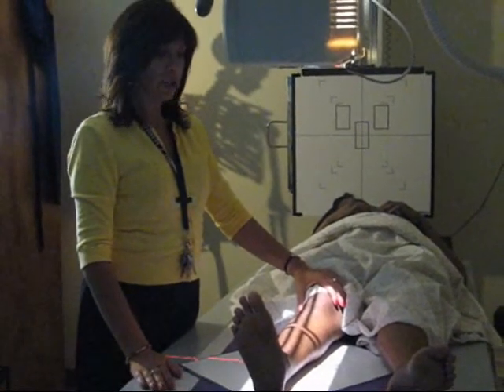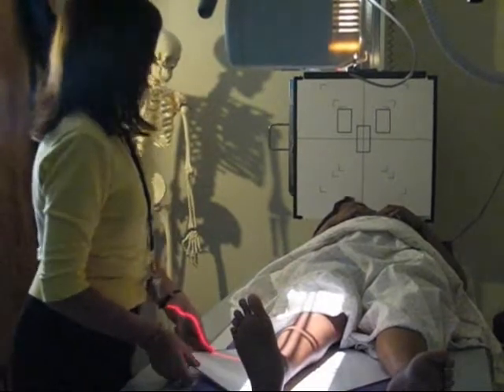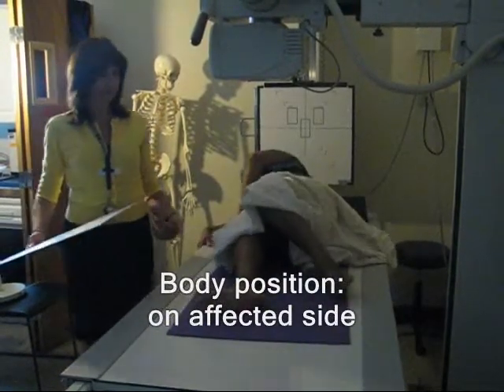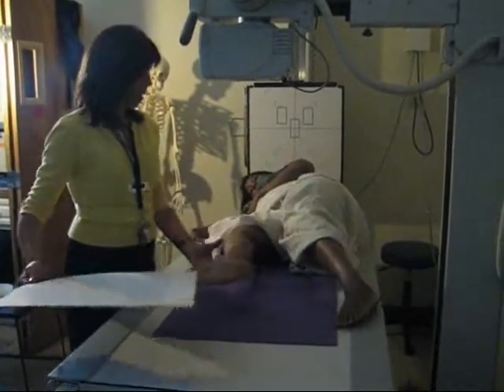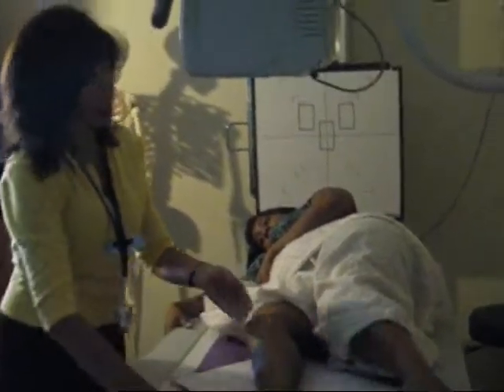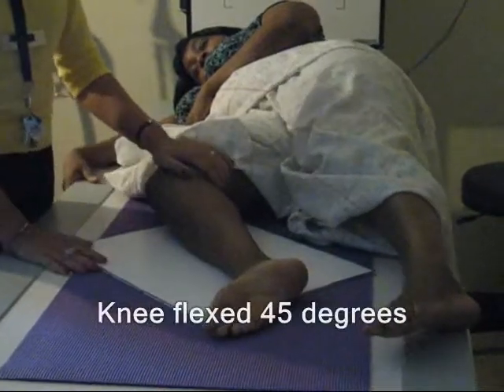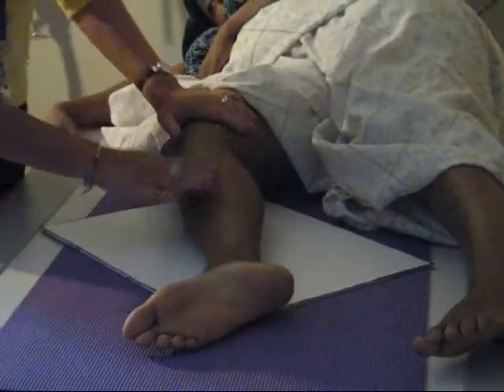Next routine projection for the tib fib is the lateral, and we're going to ask our patient to lay on her side towards the affected side, or with the affected side closest to the IR. And same concept, you want both the joints in, so you're going to have her bend her knee about 45 degrees. It's a little too much. There. Okay.